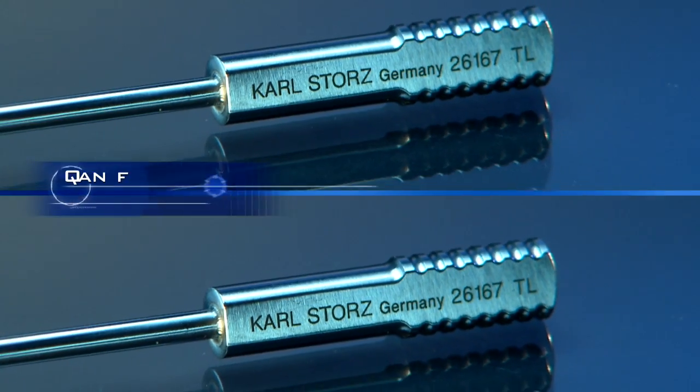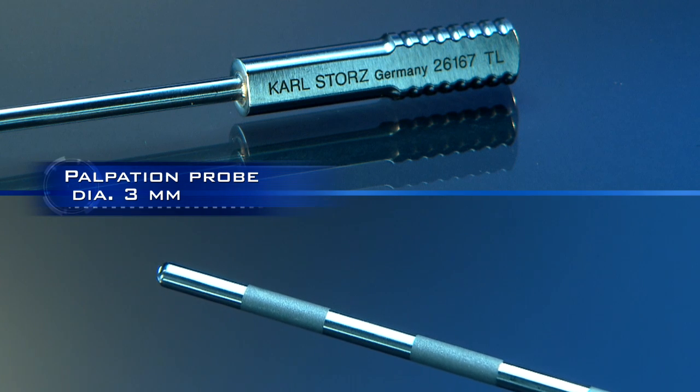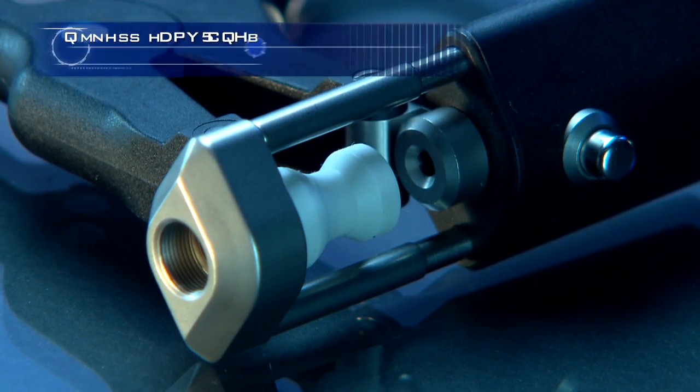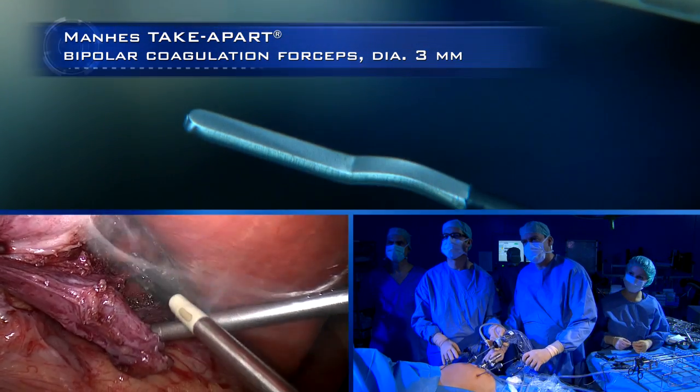A graduated palpation probe similar to the 5mm model. This 3mm set even includes bipolar grasping forceps, allowing the surgeon to use bipolar coagulation if he wishes.